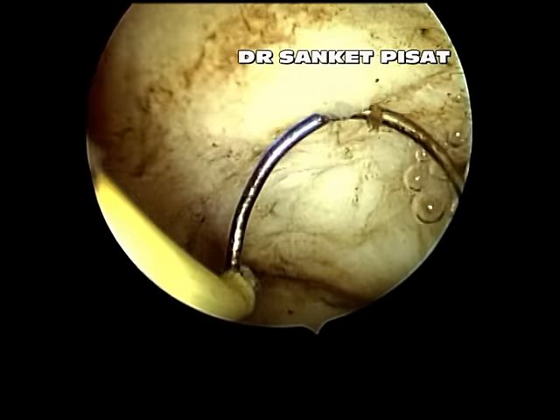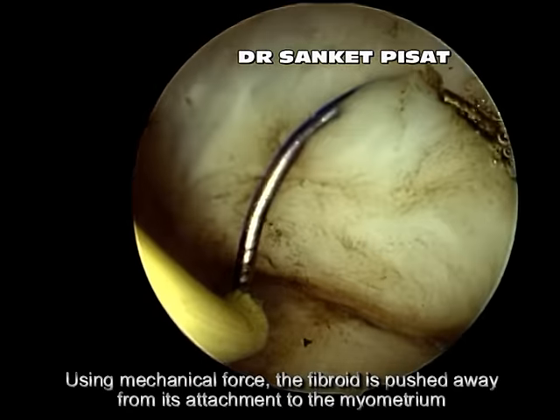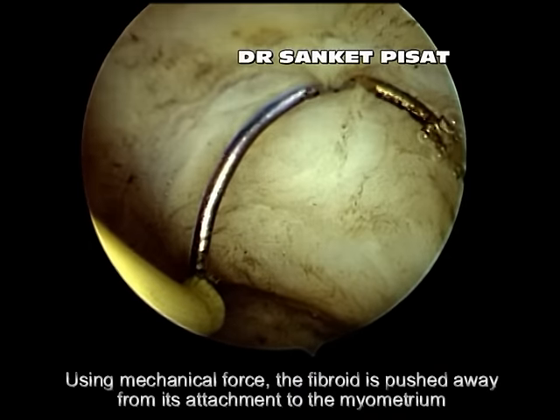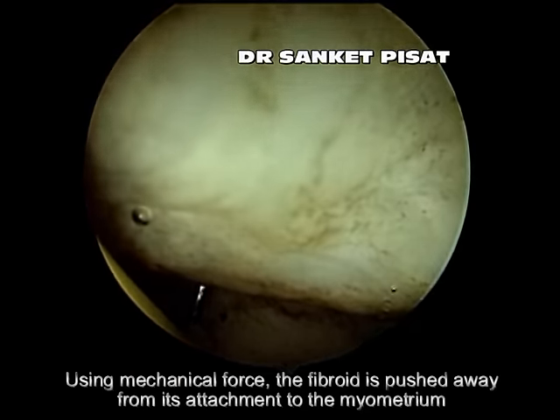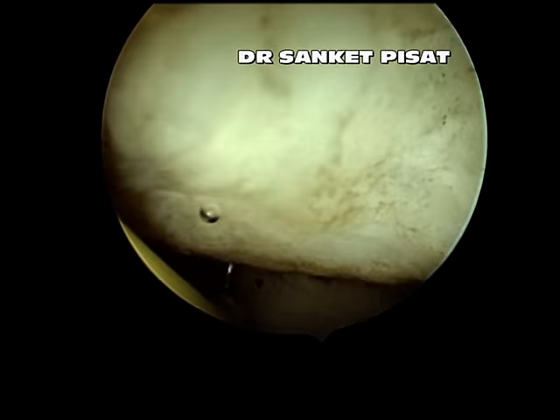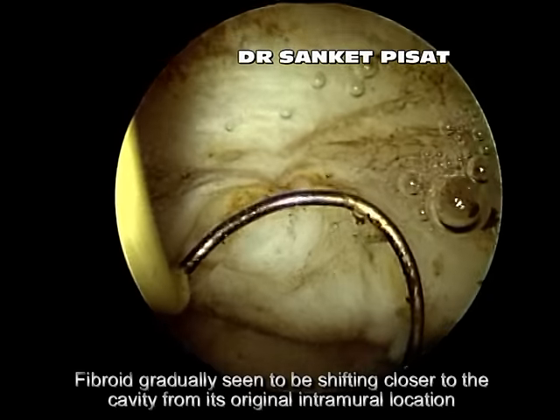Using mechanical force, the fibroid is pushed away with the resectoscope loop, and gradually the fibroid is seen to be shifting closer to the endometrial cavity. This displacement is sometimes accompanied by short bursts of energy in order to release the restraining fibers over the circumference of the fibroid that are holding it back.